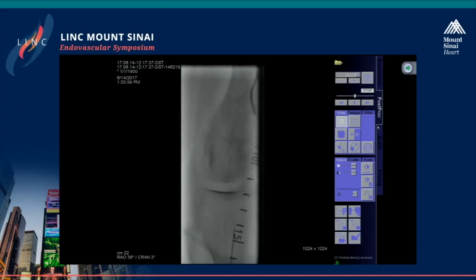All right, show me the catheter. Let's see whether we can do what Andre does, which I've never been able to do. Let me see. Any tips here, Dirk? I know you and Andre have done that. Oh, there we go. Wow. Oh, my God. Track it up. PK, you make it look so easy. Wait, you're not railing. You're like a poker player who says he's never good at poker.